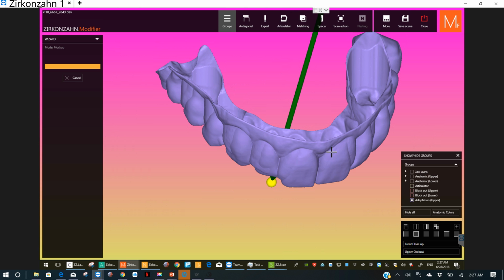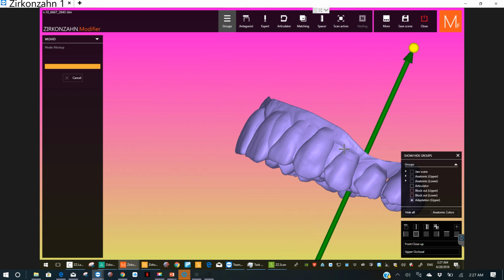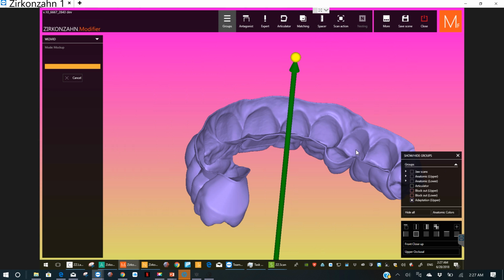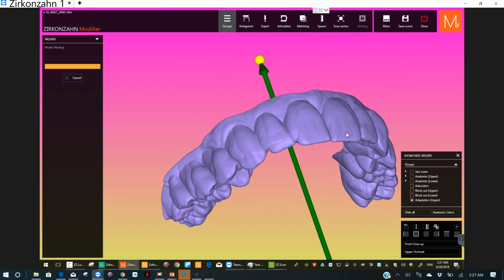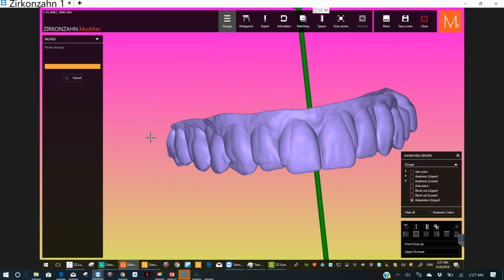And we could fill it with Fluxitemp and just leave it. Or we could have it so they can take it in and out. I think this kind of makes up for the Essex tray almost. Anyway, pretty sweet.